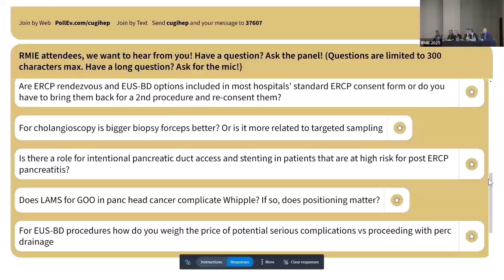Wonderful. Maybe go ahead. The other aspect of the question was also pancreatic stent insertion. And I think for us, usually we'll leave the wires and try and do everything with the bile duct, and then at the end come and put in the pancreatic stent. It's a trade-off, obviously, because sometimes things happen during the procedure and you fall out and so on.